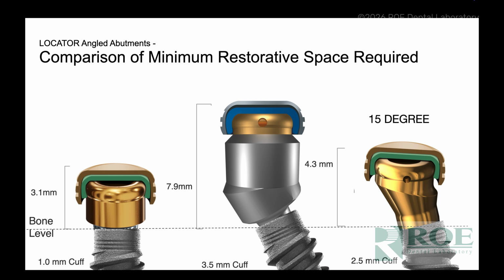Prior to the angled abutment, there was a special abutment that we could place onto an angled MUA abutment, but it required this little sleeve that really increased the restorative height of that system, and sometimes it took up so much space that it wasn't reasonable to use it.